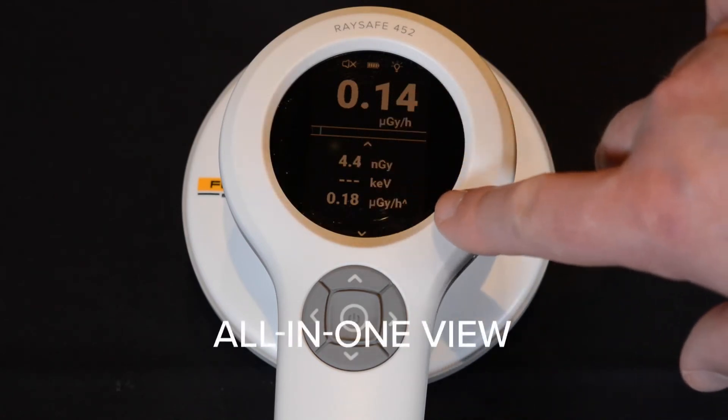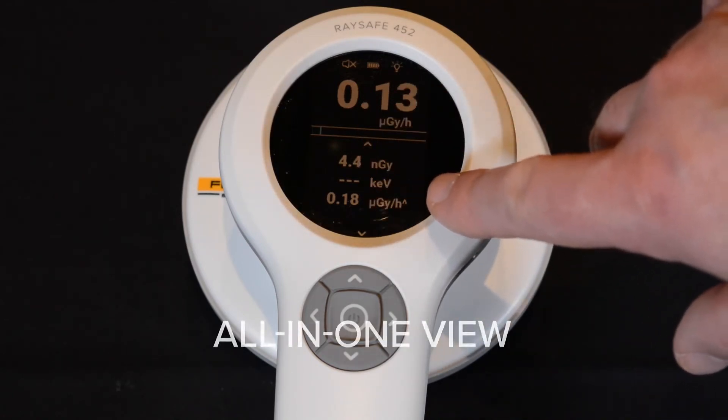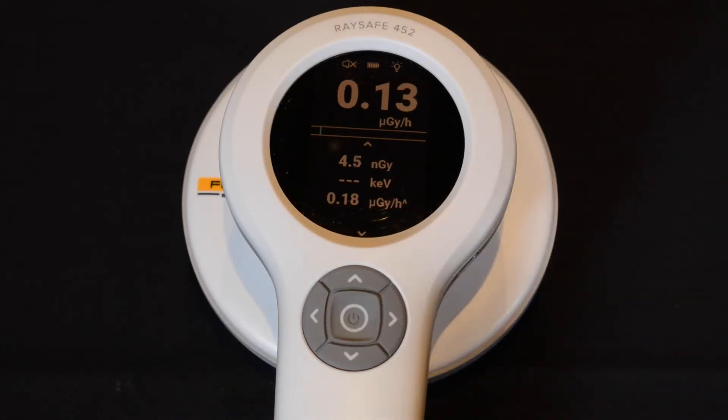When using other instruments, you might have several modes, but with the 452 you have everything all in one. There is no need to select anything. It's all automatic.